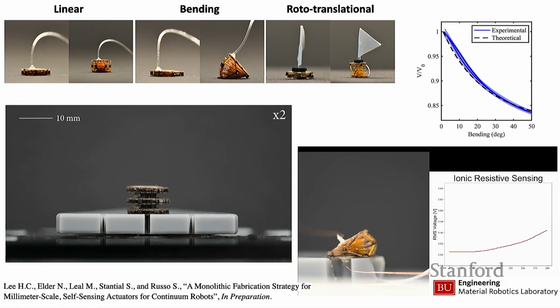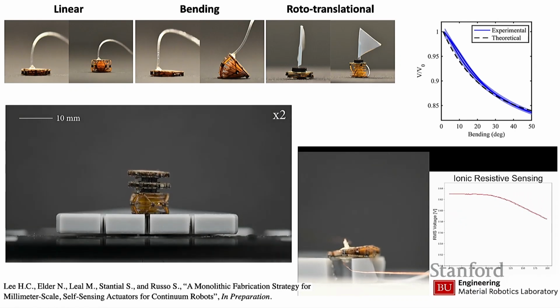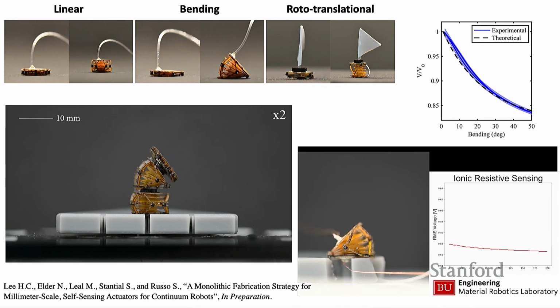And last but not least, I just want to mention quickly recent work that we are currently doing on soft-rigid robotic systems, and this is work by my PhD student Brian, who has developed a really interesting manufacturing technology, again based on laser precision micromachining and chemical surface modification of soft materials, to integrate these soft origami-inspired actuators inside origami rigid structures. And the way he's doing that, there is no manual assembly of these soft actuators. Everything is already thought about as a batch manufacturing procedure. So you can scale these down as much as you like, and you can assemble them pretty quickly without human error.